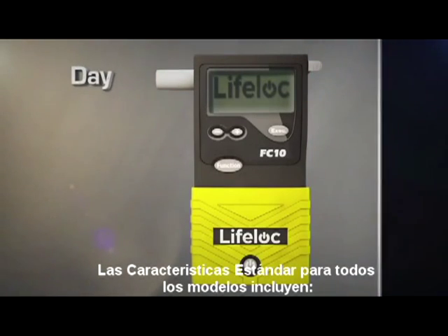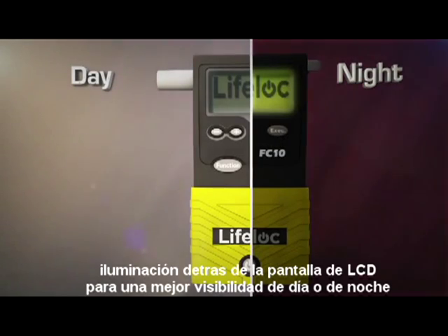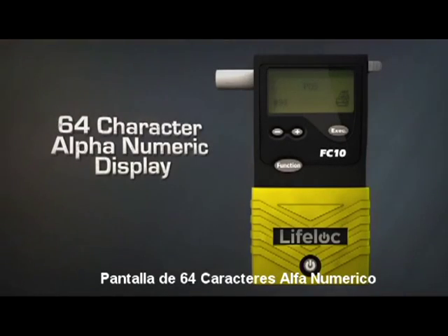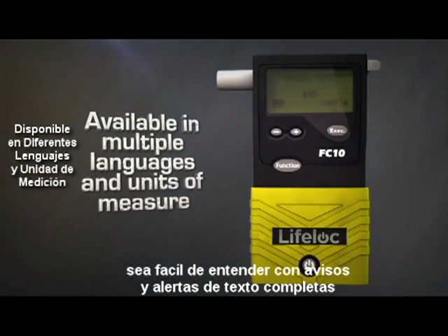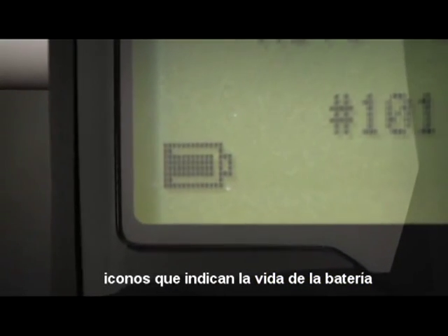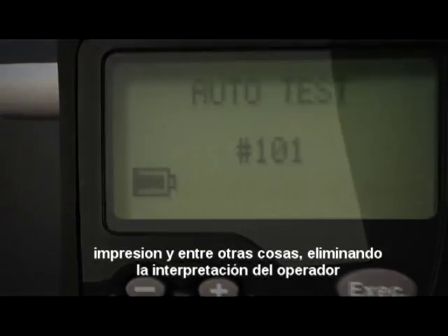Standard features across all models include a backlit LCD for excellent day or night visibility, a 64 character alphanumeric display that communicates with the user providing easy to understand operator prompts and full text alerts. Icons are used to indicate battery life, printing, and other prompts, eliminating operator interpretation.